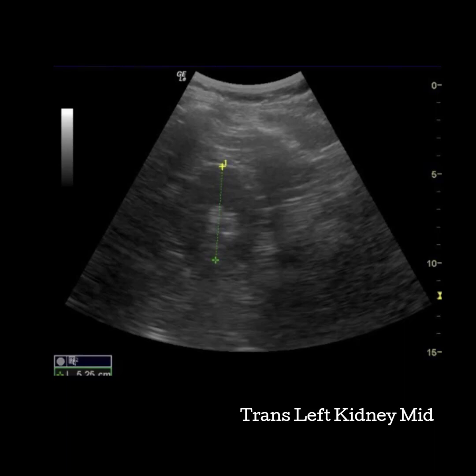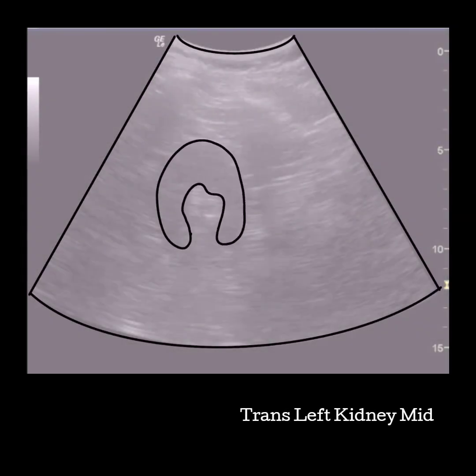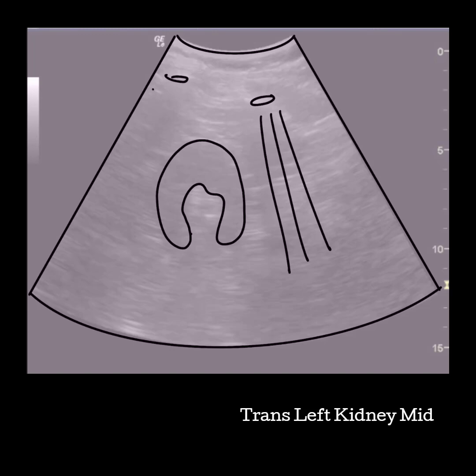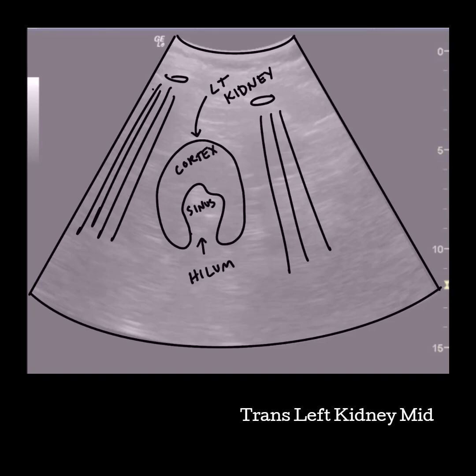Some sonographers choose to do their AP measurements and cortex measurement in the transverse plane instead of the longitudinal plane. The transverse left kidney is the only image that appears to take on a mirrored appearance of the right kidney. You'll notice that if you do not see other organs in your images, there is not a good way to tell left from right, which is why it is imperative you label your laterality in paired organs and limbs.